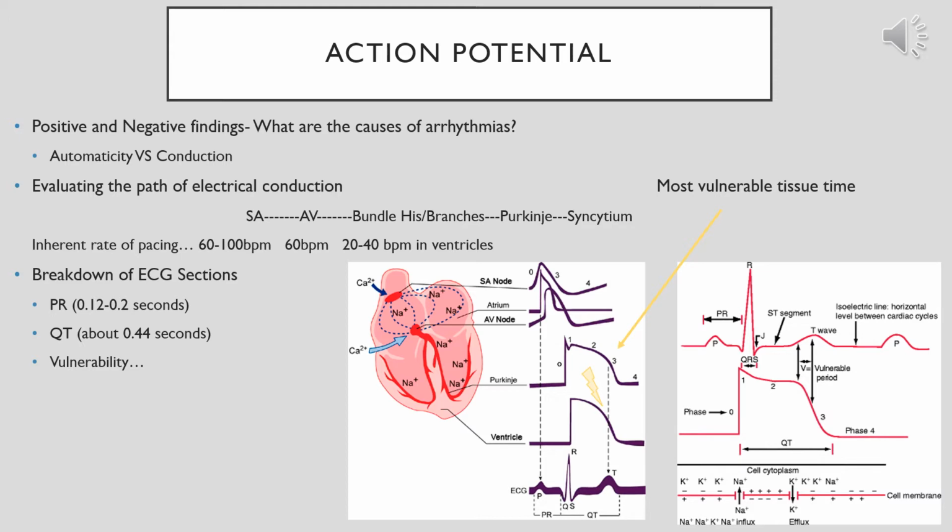Generally, you have specialty providers that may be providing digitalis or other antiarrhythmic medications. However, you may want to know that your patient has an already prolonged QT interval before starting a fluoroquinolone antibiotic or something like that, because that could be good information for your prescribing practices. So it's good to have a baseline so that you can always make comparisons when we're discussing QT interval.